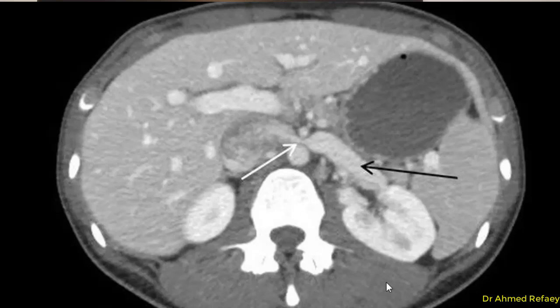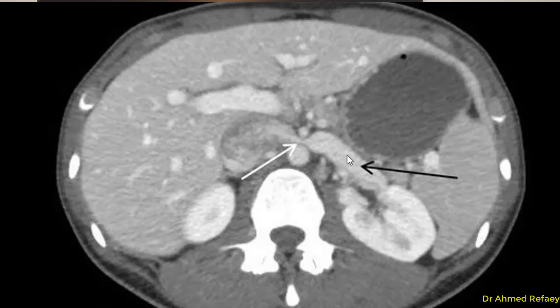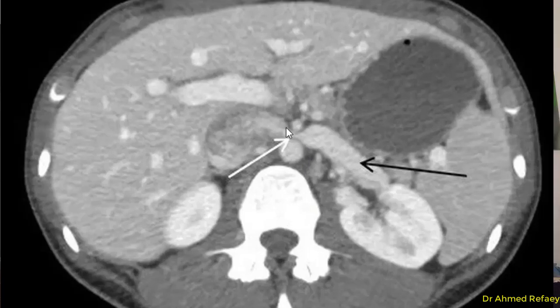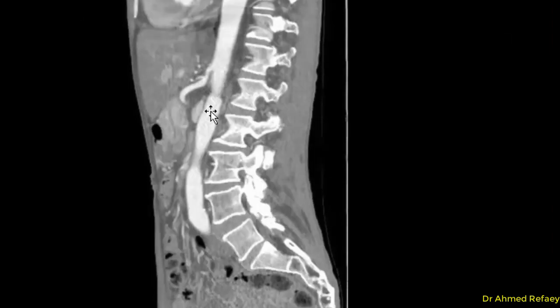Regarding the diagnosis of Nutcracker Syndrome by CT scan: on this axial CT of the upper abdomen, we can see the left kidney, the aorta, and the superior mesenteric artery. The proximal left renal vein is markedly dilated compared to the markedly stenosed or compressed segment of the left renal vein as it passes between the superior mesenteric artery and the aorta. The compression ratio can also be measured here — the caliber of the proximal dilated renal vein divided by the caliber at the region of stenosis.